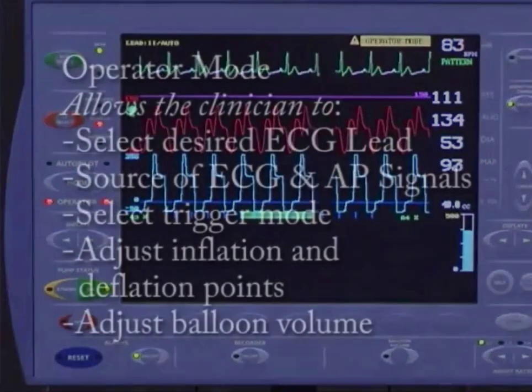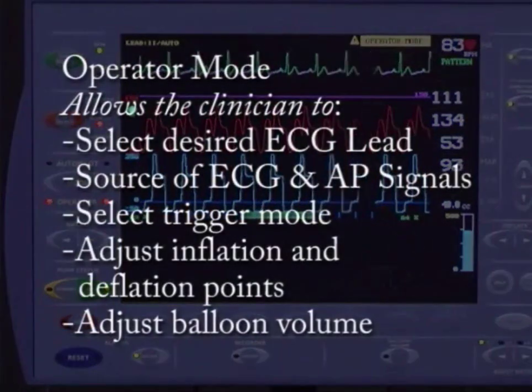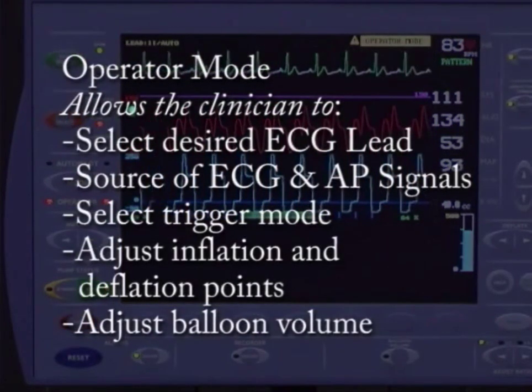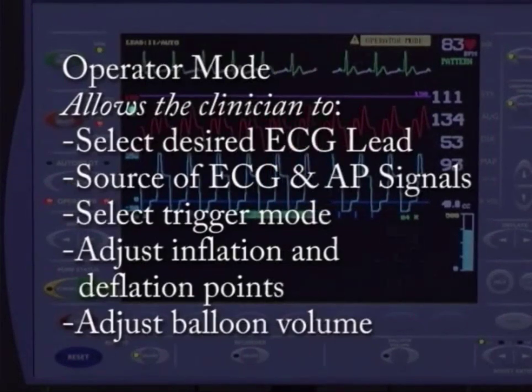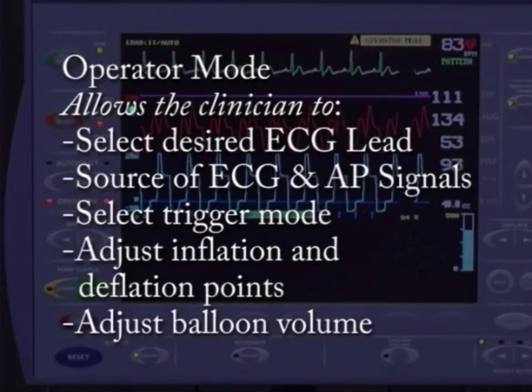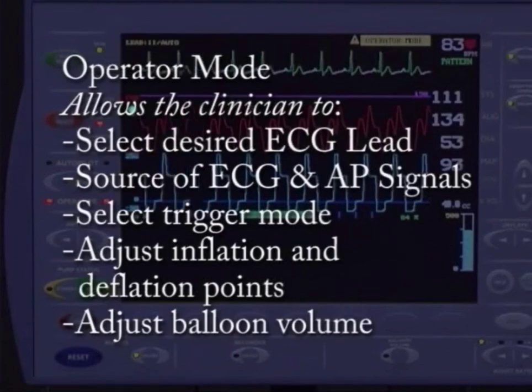Operator mode allows the clinician to select the ECG lead, source of ECG and AP signals, desired trigger mode, as well as setting the inflation and deflation points and desired balloon volume.